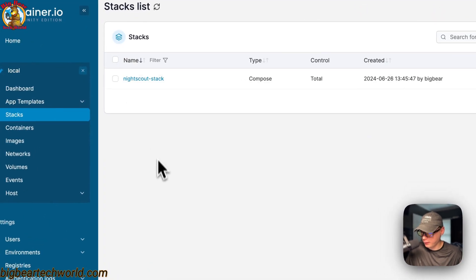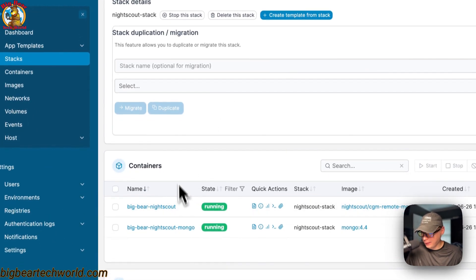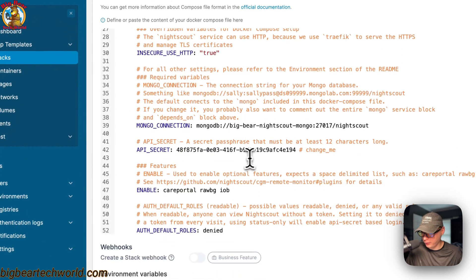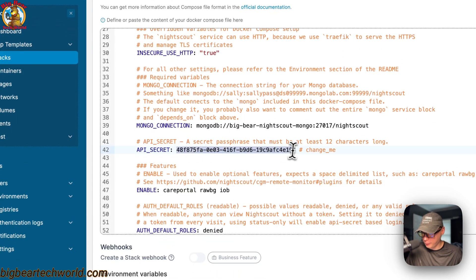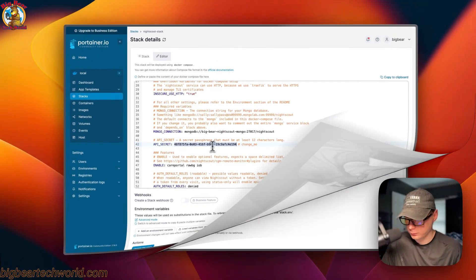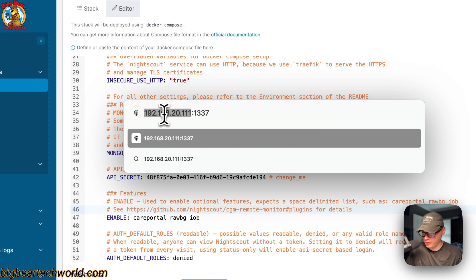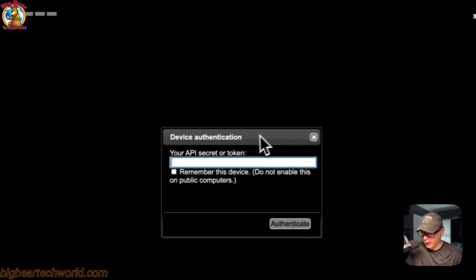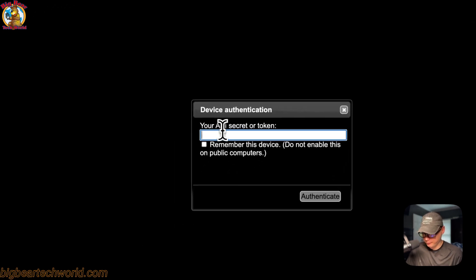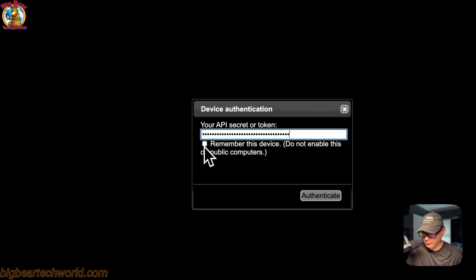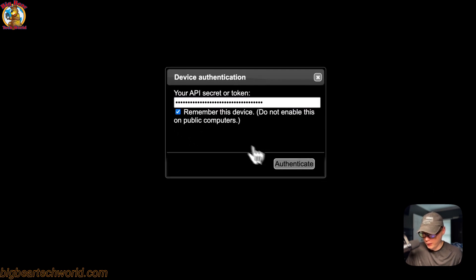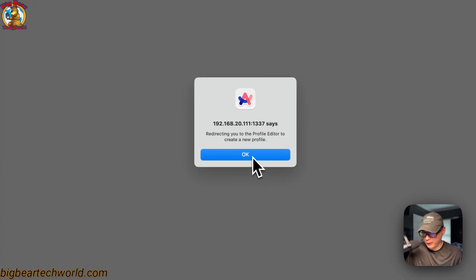Now I'll go into the stack, then Nightscout stack, then the Editor, and scroll down to the API secret. Copy it because you'll need it to access the UI — and I recommend changing it since it's your password. Now go to the Portainer server's IP address with port 1337. Paste in the API secret, and you can choose to remember this device — though I wouldn't do this on a computer you don't own or control. Click Authenticate.